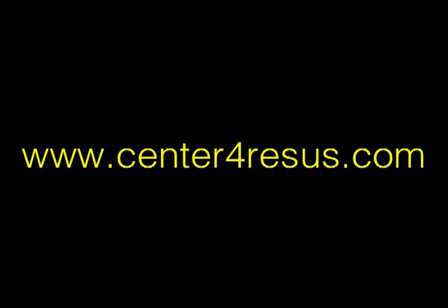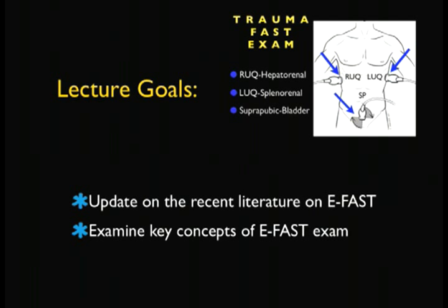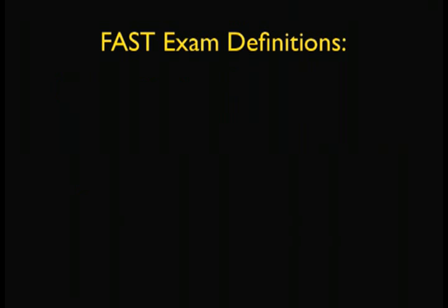Basically, I'm going to give you a couple lecture goals. I'm going to try to keep these very short and sweet. No, there'll be no test afterwards. We'll only have two goals here. Number one, we're going to update some of the literature on the extended FAST exam. And number two, we're going to look at some of the key concepts of the FAST exam in terms of actually practicing it. Okay, so what are some definitions when we talk about the trauma FAST examination?